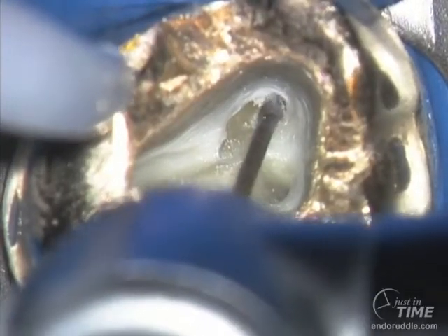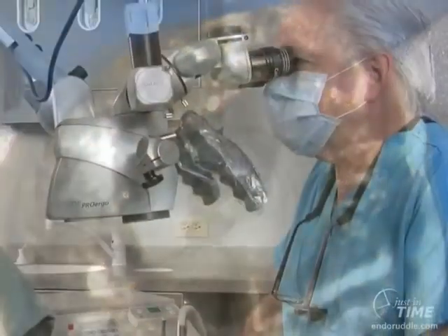Here we're brushing with a Gates Glidden 2. Now we're using a Gates Glidden 4. We can use a series of Gates Gliddens, one through four, to relocate orifices away from furcal side concavities. The bigger Gates Gliddens can be used to marry the orifices to the axial walls.